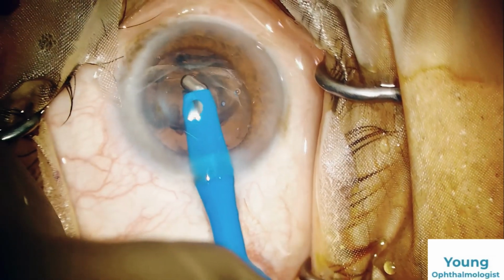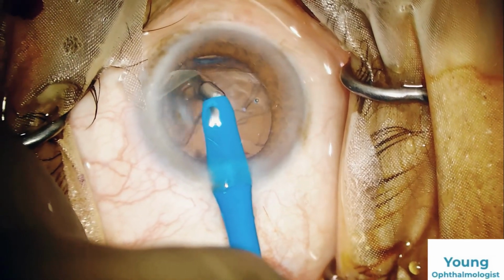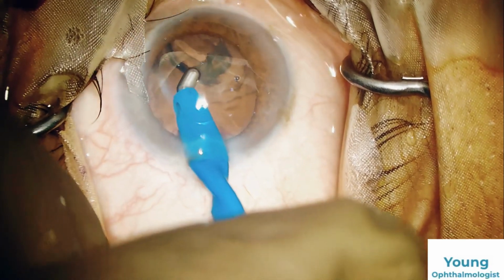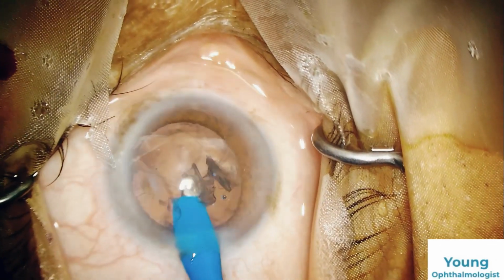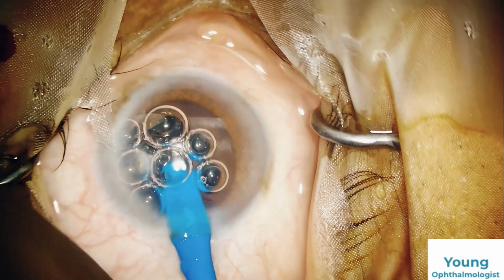Here the vacuum is 400 and the flow rate is 35. For safety, my probe is in the center. We are aspirating with full vacuum in the center of the eye. Only a few cortical tags are remaining.